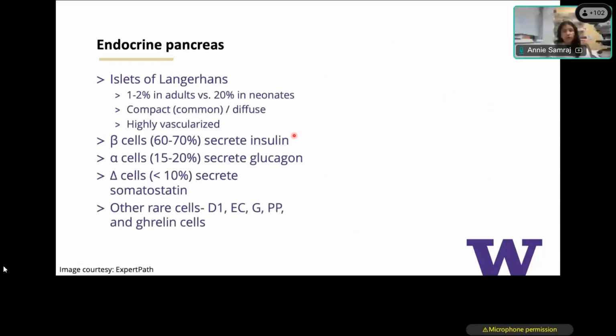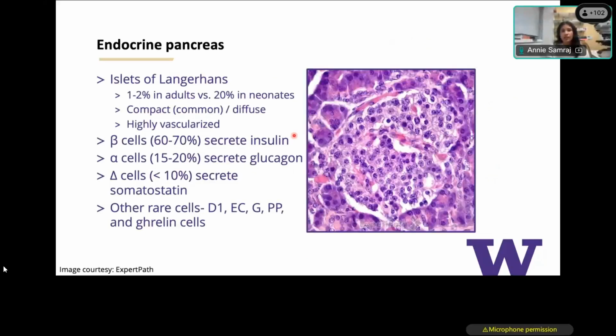And now let's talk about the endocrine pancreas. The endocrine pancreas is scattered within the parenchyma of the pancreas. These are known as the islets of Langerhans. They're very easy to identify because they're very pale staining compared to the very deep, beautiful purple of the acini. And notice the main difference between an exocrine and an endocrine organ is that exocrine has a duct system and local action.